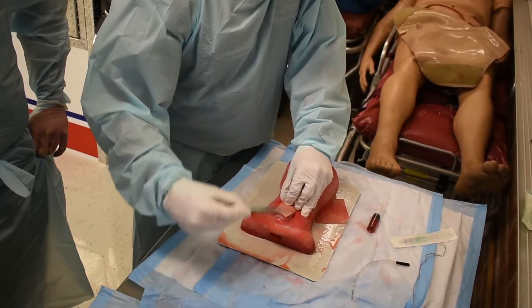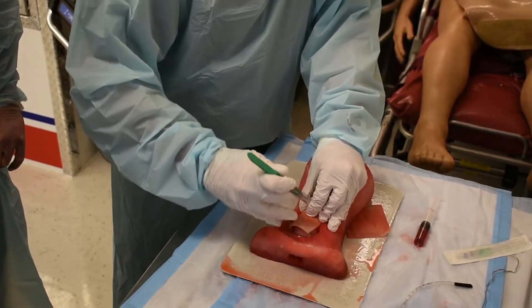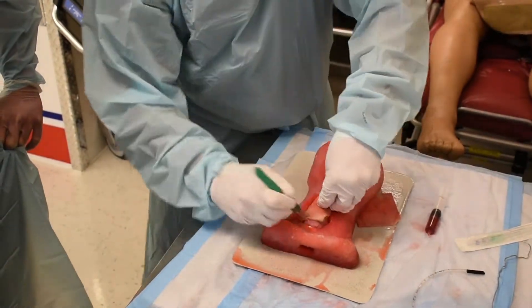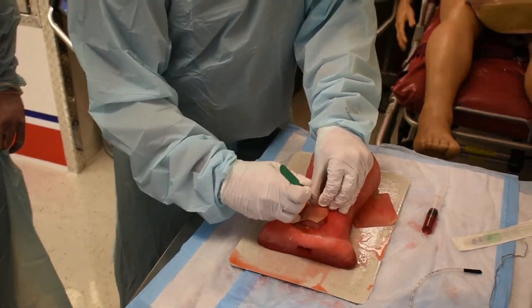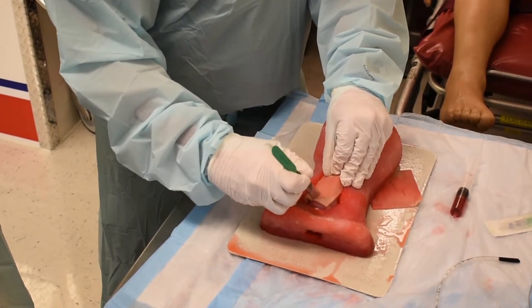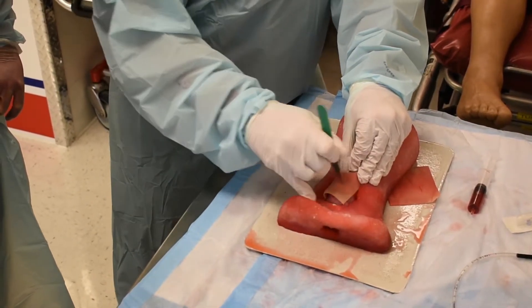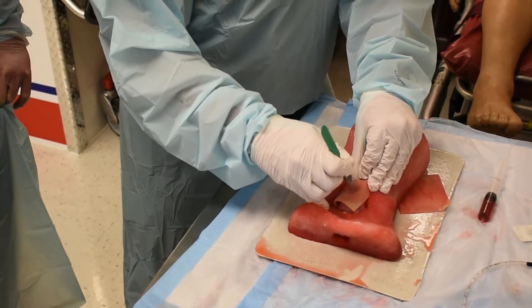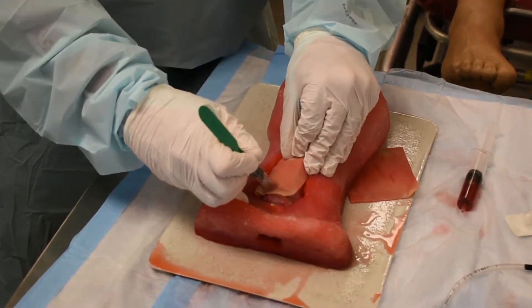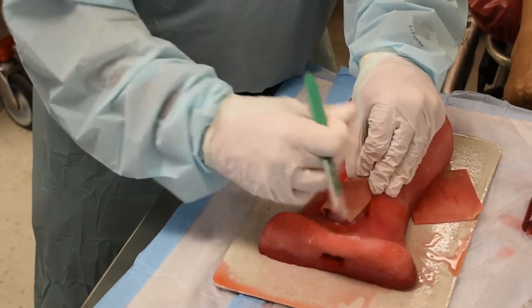This is your surgical hand. We're not cutting up chicken, so act like a surgeon. One or two fingers will rest on the patient's chest cavity to stabilize you so you won't be shaking. As soon as I find my landmark, I back my finger up and make my incision — vertical first, then transverse. In the state of Arizona, your medical direction requires vertical to transverse. Make that incision straight and at least an inch long. Don't shortchange yourself — we can always fix it in the OR later.